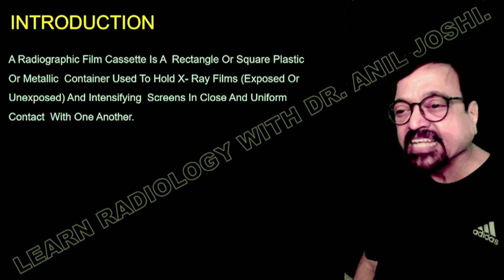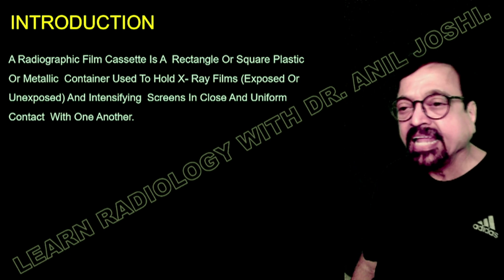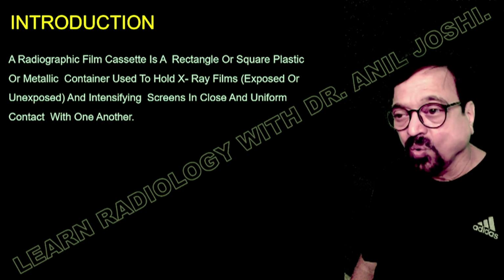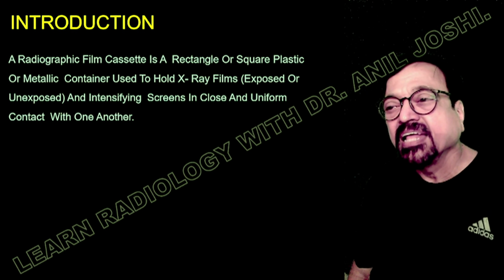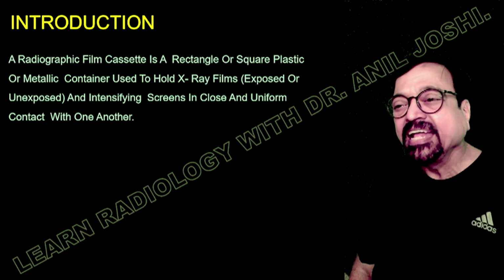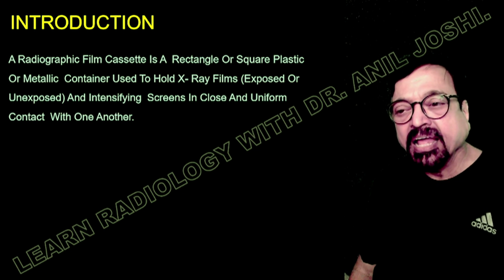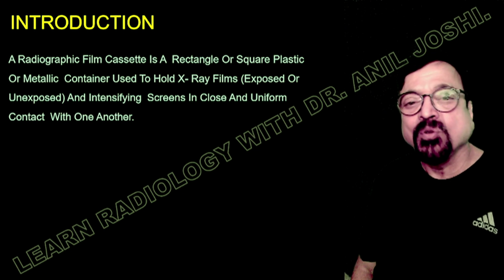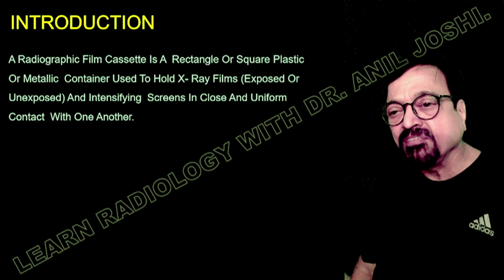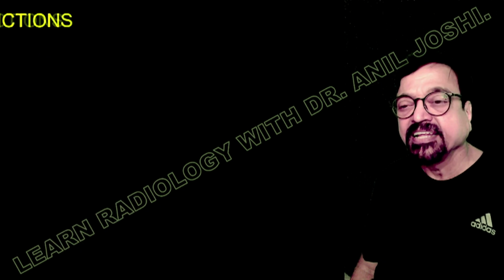A radiographic cassette is a square or rectangular shaped metallic container used to hold a film, exposed or unexposed, and identify which is front and which is back, which are also mentioned on the film, and to load the film. Film loading is the same for double coated film, but in single coated film you must know about the back side and the front side of the cassette.